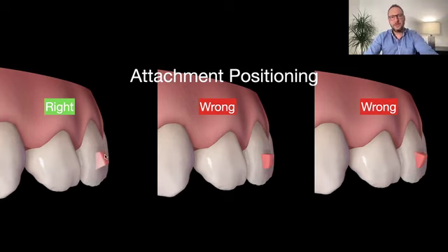So why do we place it up? Because for this situation, we are just using the attachment for retention, okay? If we just need to intrude, then we don't need an attachment. We just need to leave it, and the plastic is going to have all the incisal edges and the crown to work against the plastic, against the crown, to do the intrusion. But if we want to do inclinations, we want to avoid intrusion, or we want to rotate the crown, and we need a retention in order to achieve this, then we need to place an attachment, and this is the ideal position, okay?